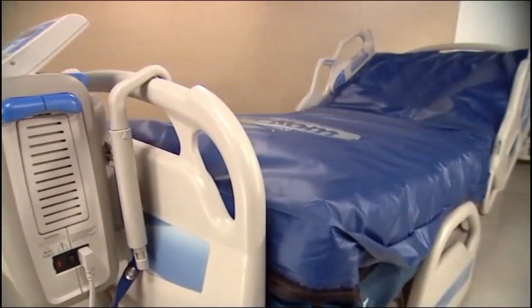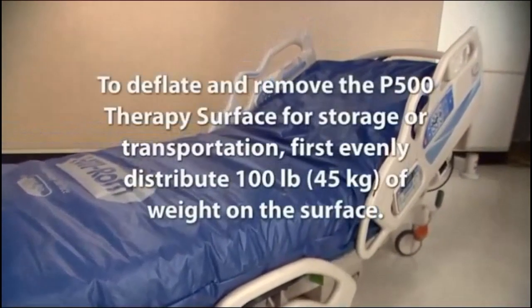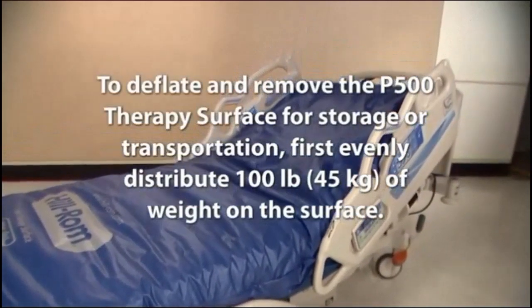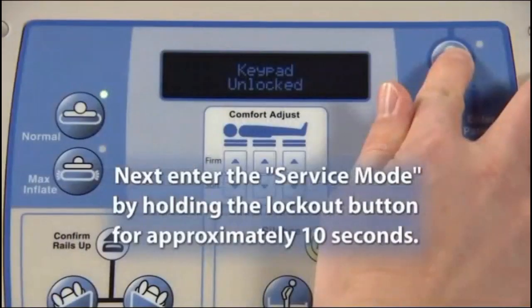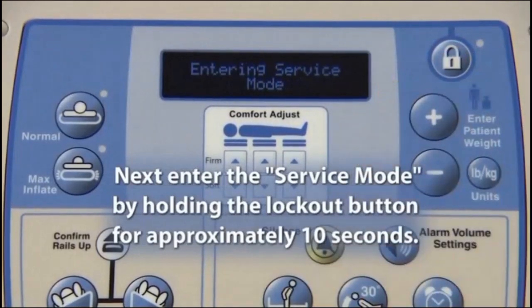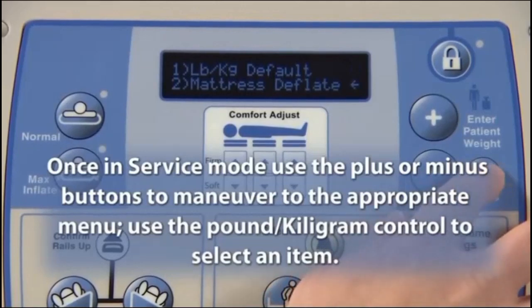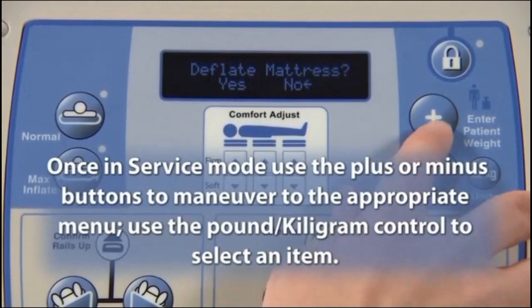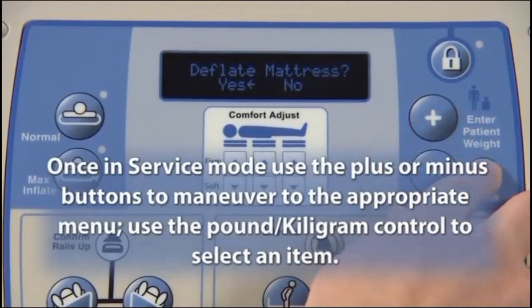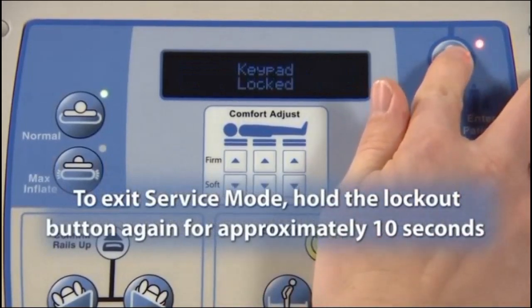To deflate and remove the P500 Therapy Surface for storage or transportation, first, evenly distribute 100 pounds or 45 kilograms of weight on the surface. Next, enter the service mode by holding the lockout button for approximately 10 seconds. Once in service mode, use the plus or minus buttons to maneuver to the appropriate menu. Use the pound-kilogram control to select an item. To exit service mode, hold the lockout button again for approximately 10 seconds.